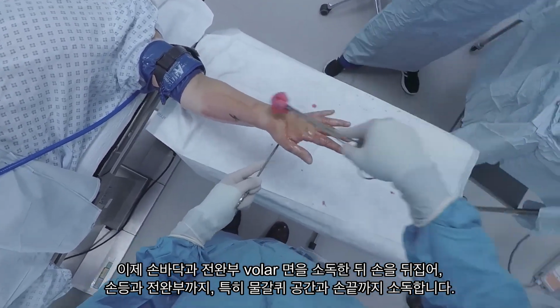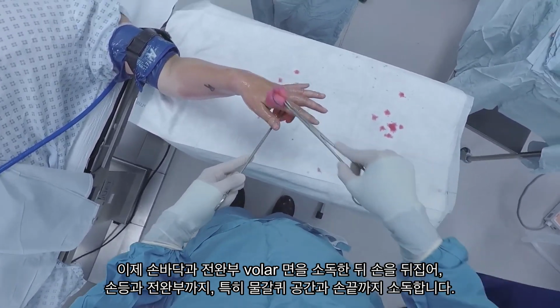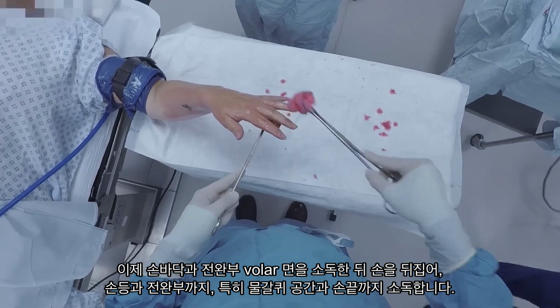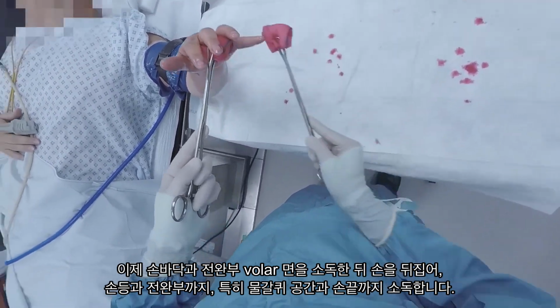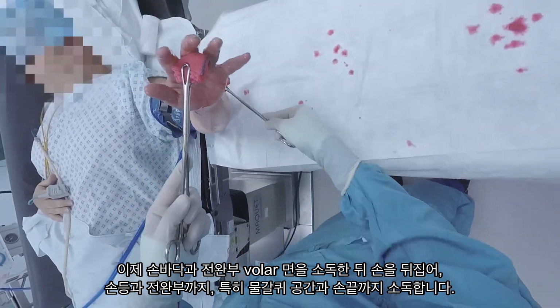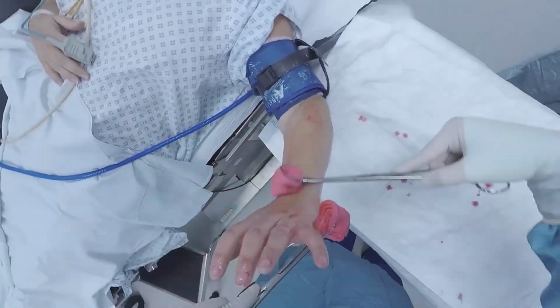Your drape will be placed around the proximal forearm, so make sure to prep up to the elbow. Finally, make sure you prep well in the web spaces and on the fingertips around the fingernails, and don't forget the ulnar border of the hand and forearm. It doesn't really matter what order you do this all in, as long as you're systematic.